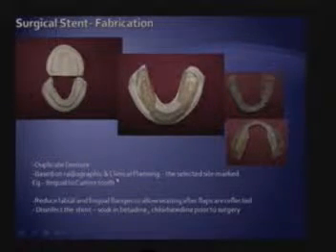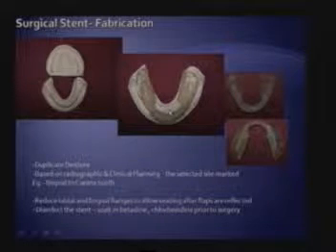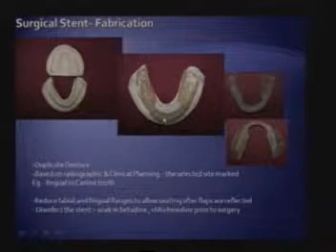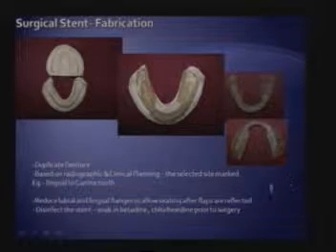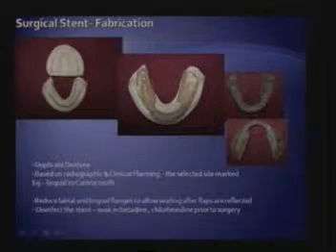Generally, suppose it is for this patient, it is lingual to the canine, so we know where our initial osteotomy punch cut will lie, and therefore we can have a proper placement of the implant. Secondly, these stents have to be disinfected prior to surgery.